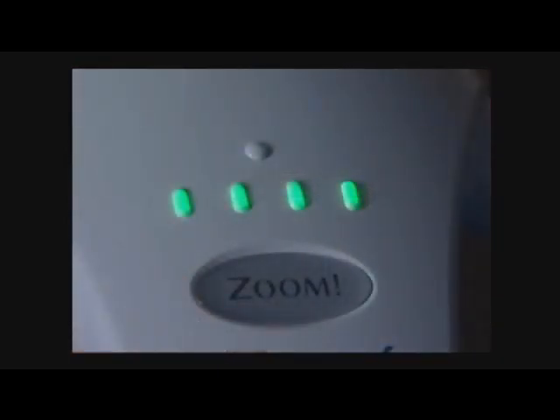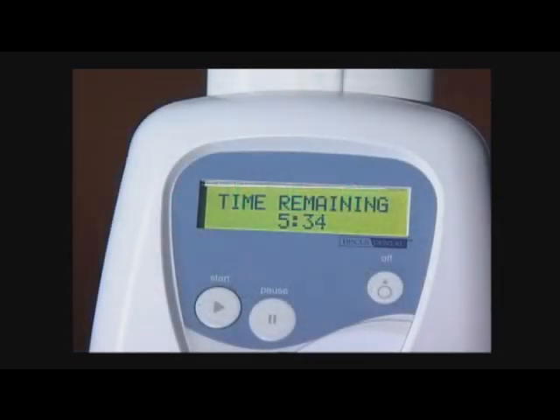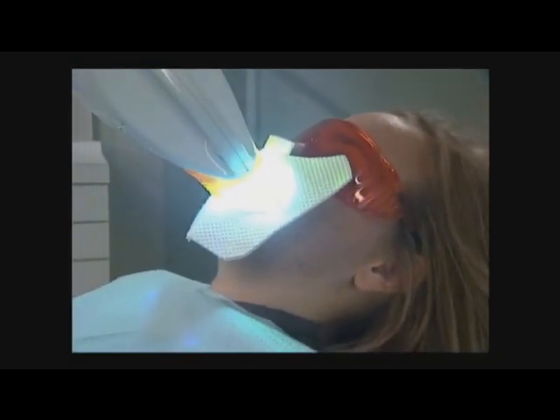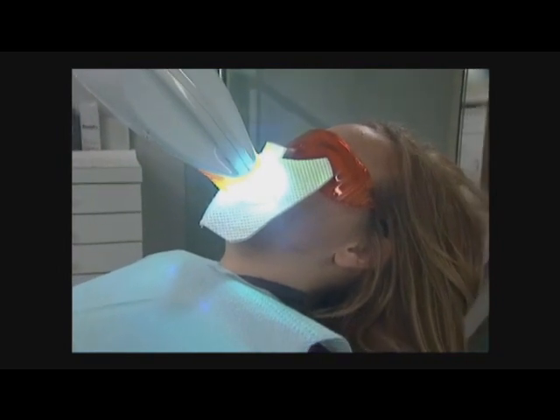Point out to the patient that the progress of each session will be tracked by 4 lights on the top of the lamp head. A light will appear for each 25% of the session. These lights are also helpful for checking on the patient's progress and time remaining.